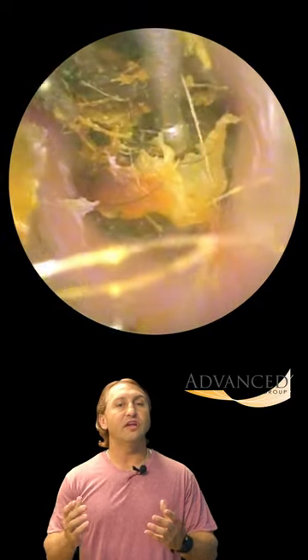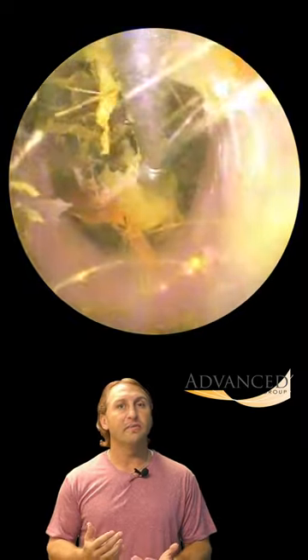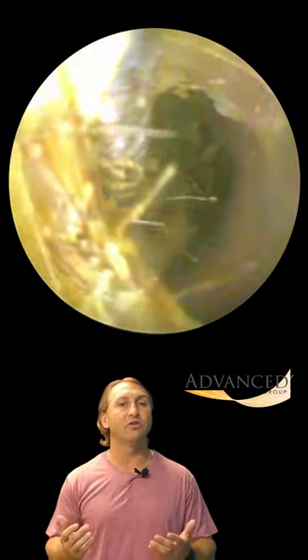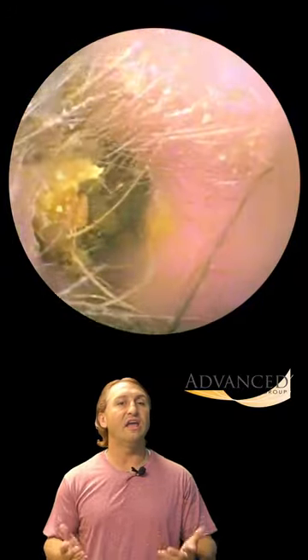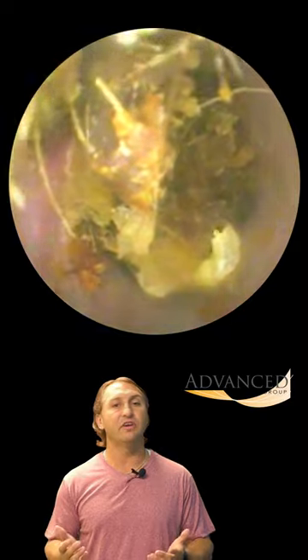Right now we're using the curette. You can see that the wax closer to the opening of the ear or the aperture is actually a lighter color. That lighter colored wax is much softer. The darker wax has been in there longer and is more hard. We're going to switch to a more angled curette in a minute because what we're having trouble doing is getting it off the ear canal wall given the shape of their ear canal.